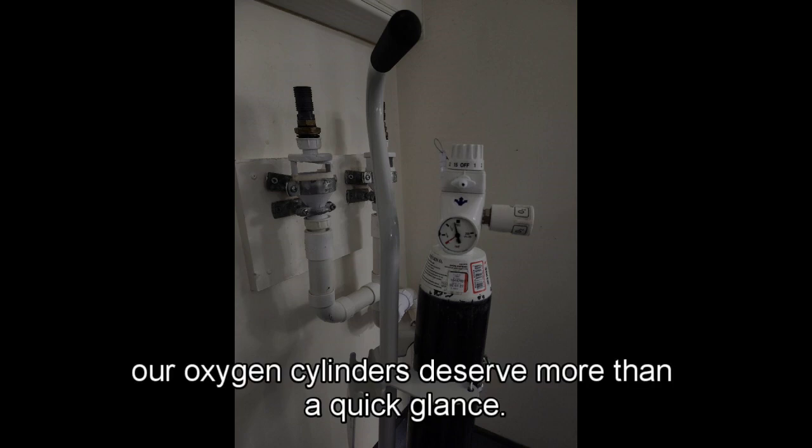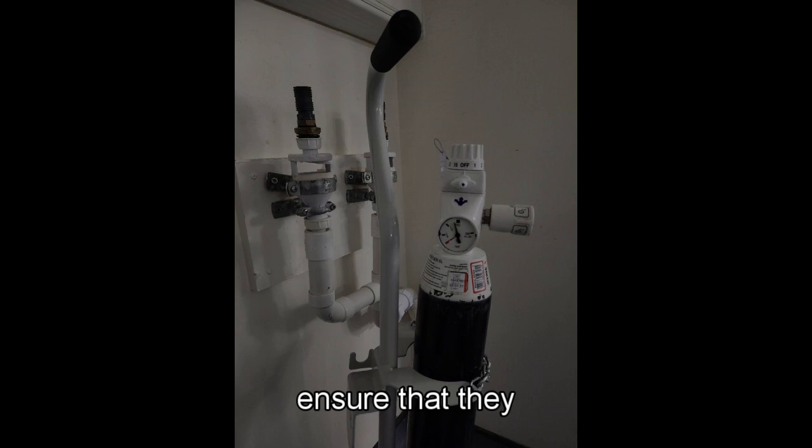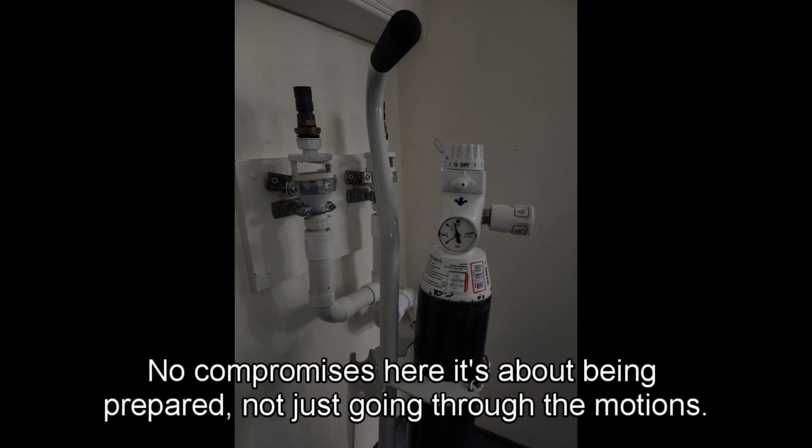Let's start with the equipment check. Our oxygen cylinders deserve more than a quick glance. Ensure they are filled to the brim with oxygen. No compromises here. It's about being prepared, not just going through the motions.